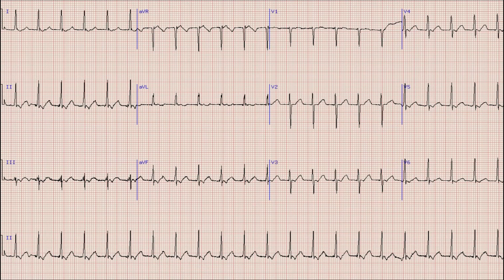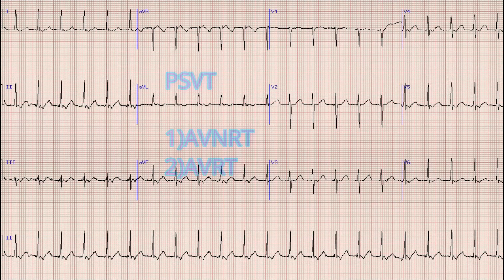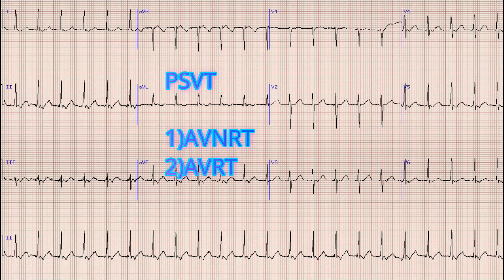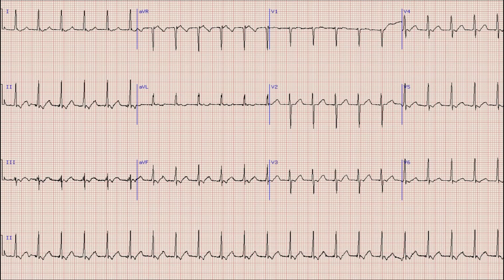We are therefore left with one differential: paroxysmal supraventricular tachycardia. In paroxysmal SVT there are two types of pathways. One is AV nodal re-entrant tachycardia (AVNRT), where the accessory pathway is located within the AV node. The second is atrioventricular re-entrant tachycardia (AVRT), where the accessory pathway is outside the AV node — known as WPW syndrome. The definitive diagnosis requires an electrophysiological study.